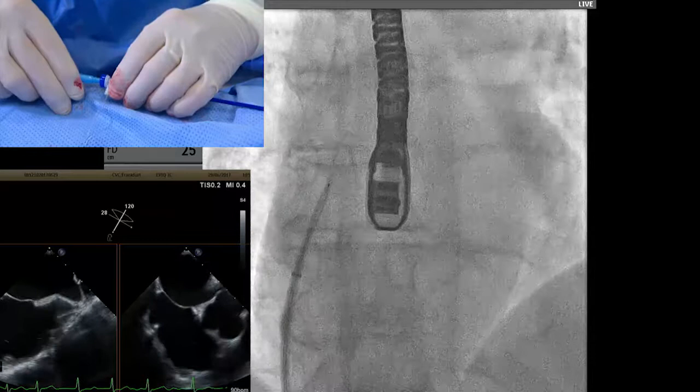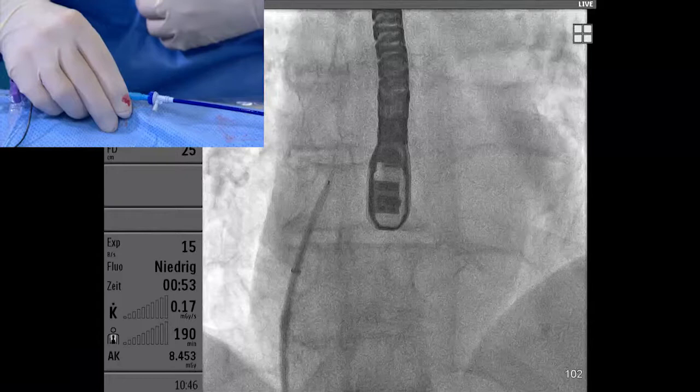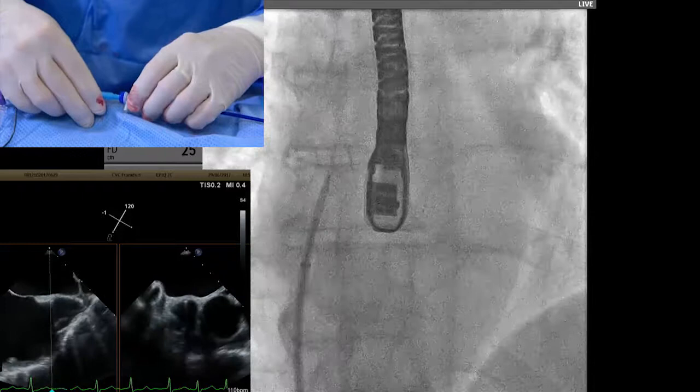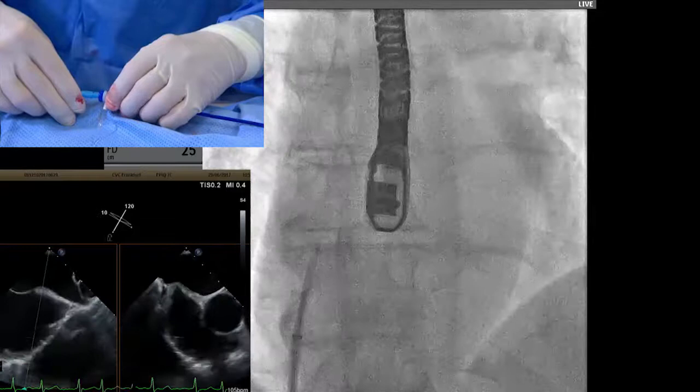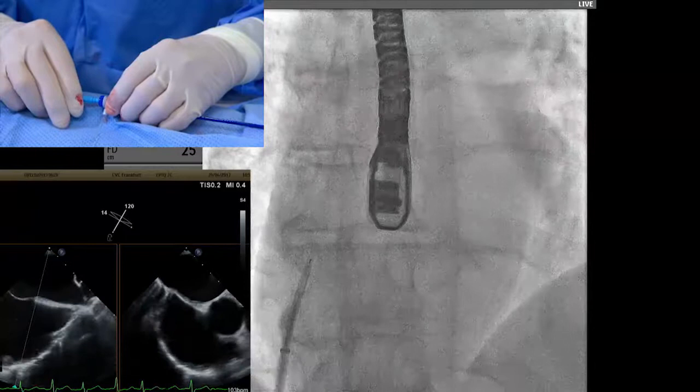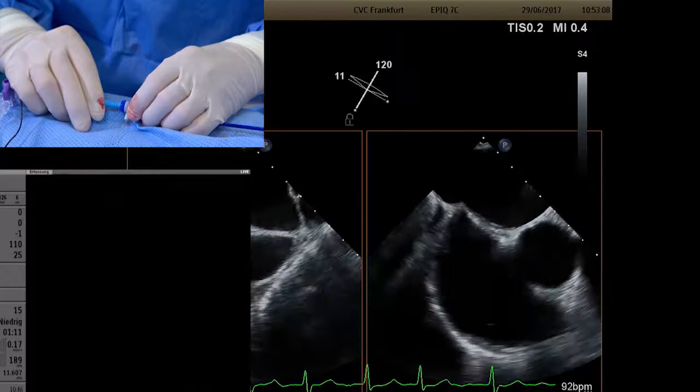You can see the tenting in the septum secundum. We check whether to go more anteriorly or posteriorly — we are a little bit anterior. Going to 6 o'clock and slowly pulling down, we are almost at the fossa. It becomes a bit too posterior, so adjusting to half past 5. Checking position on the long axis — it's still quite high, so going a little bit lower.